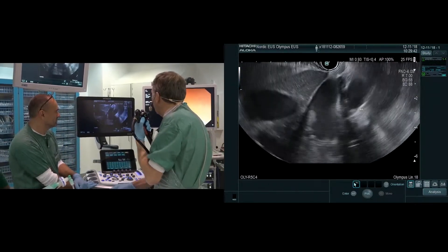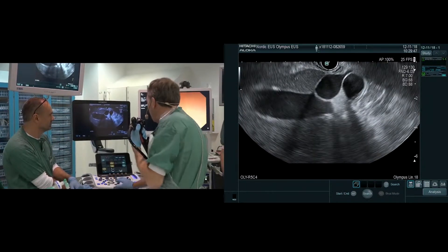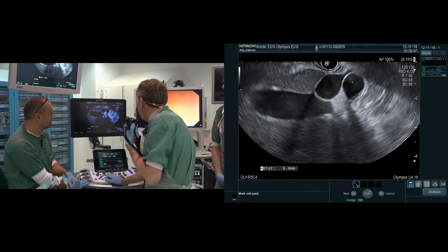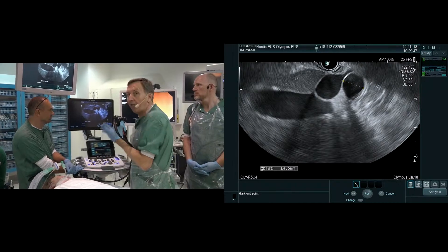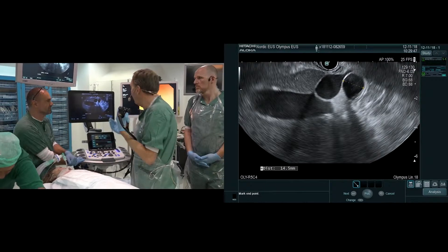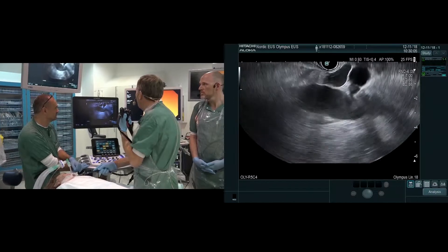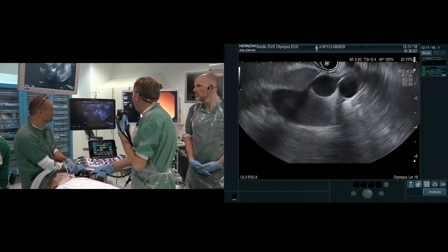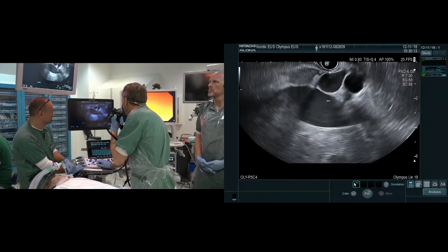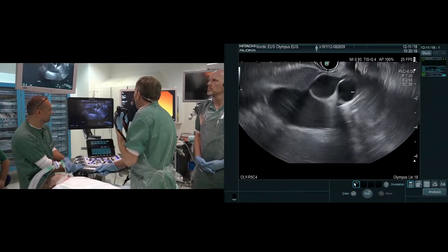I take out the color Doppler. It's easier to see the common bile duct behind the portal vein. I want to measure it — and you see it's 14 millimeters, more than 14 millimeters. So this is clearly dilated; it's pathology. We have to check whether this dilation continues further on. This may also be parts of the cystic duct here after the cholecystectomy.